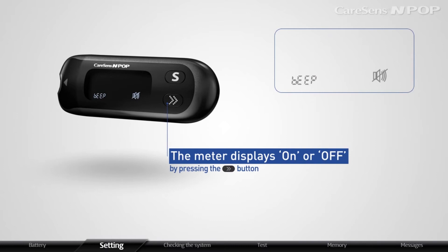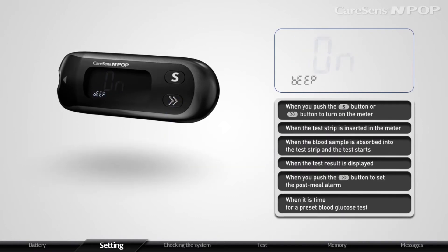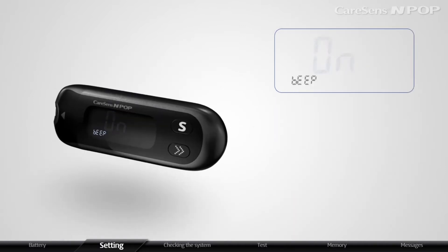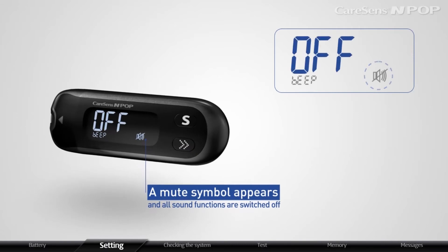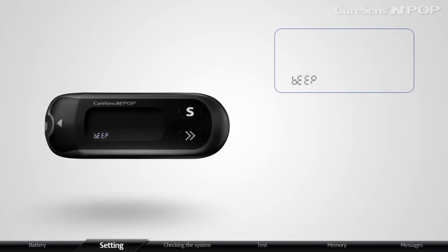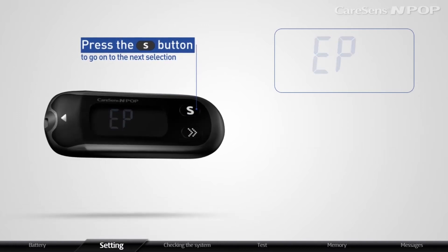You may choose on or off by pressing the S button. The meter will beep in the following instances if set to on. If the sound setting is off, a mute symbol appears and all sound functions are switched off. After setting the sound function, press the S button to go on to the next selection.